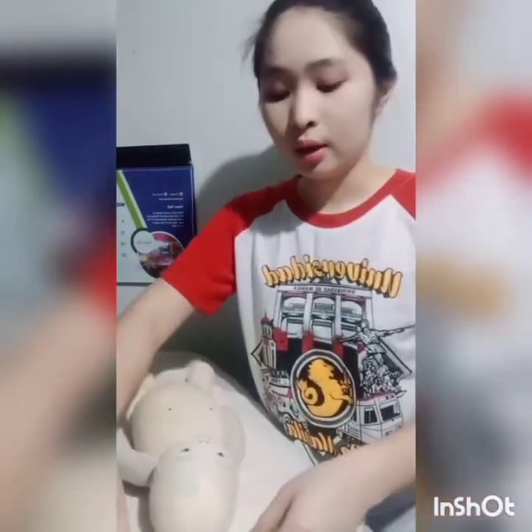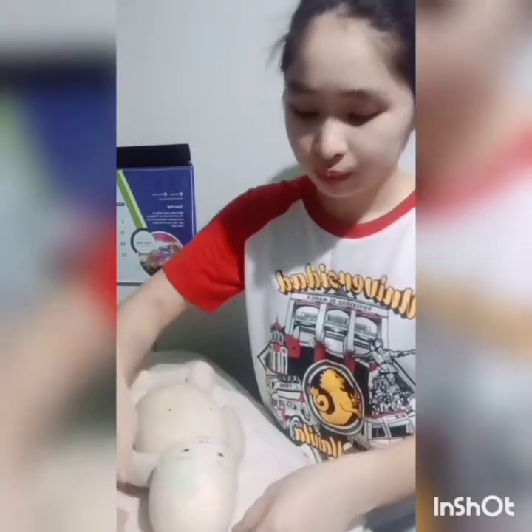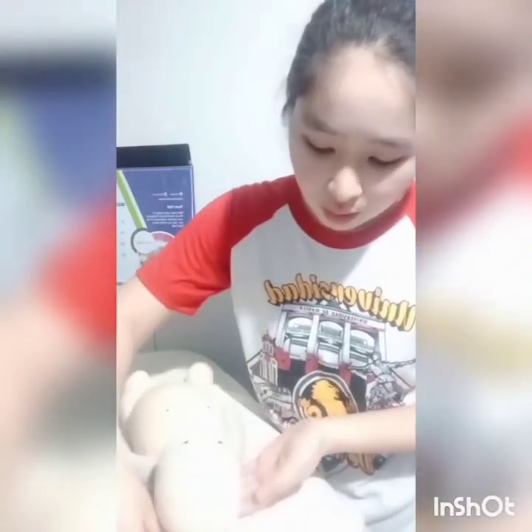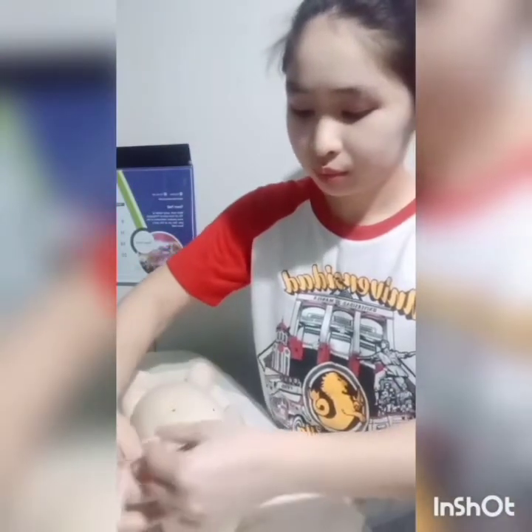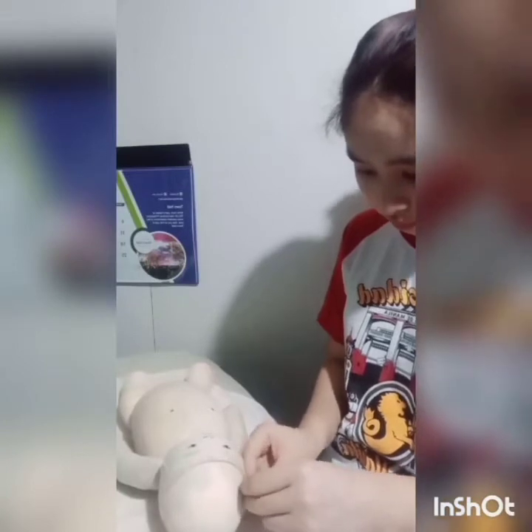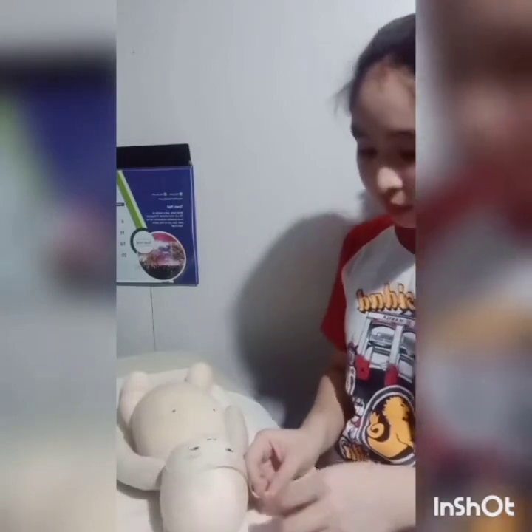Usually we're using the same landmarks in getting the measurement. Usually it is just above the ears. We're letting the measuring tape pass just above the eyebrows of the baby, and then getting the measurement just above the ears. So baby Emmy's head circumference is 28 centimeters.